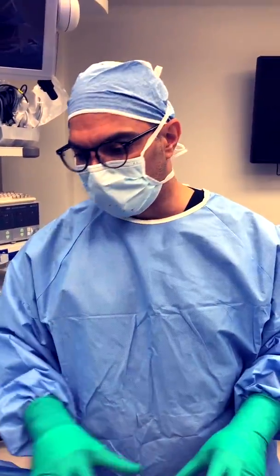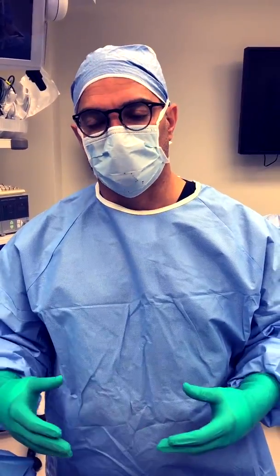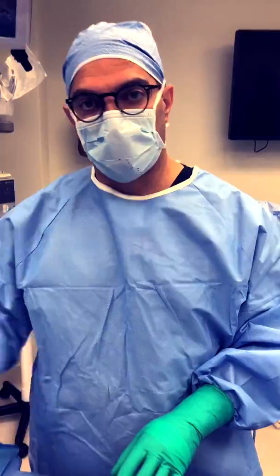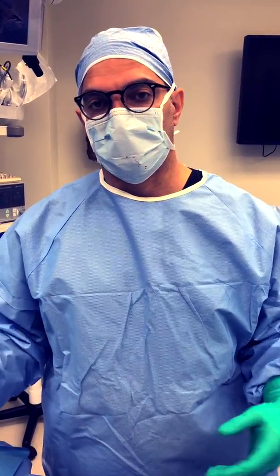As the bumps get bigger they require more work to remove — we have to cut them out and stitch them up, which slows down the surgery and the number of bumps we can address in one session. This particular patient came in early; she's in her early 30s, which is when these start to really accumulate, and we're going to take care of these bumps sooner rather than later.